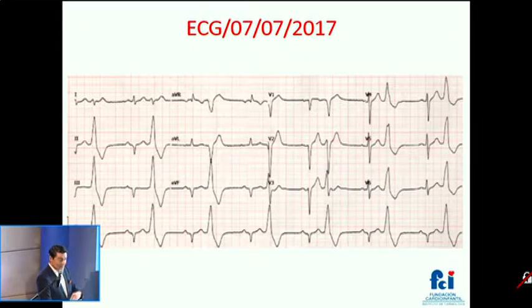When the origins of these arrhythmias start to drop in the tracts, that's when aVR can become negative, aVL can become isodiphasic and positive. So this pattern and the large voltage indicates that this is a very high structure in the heart, and according to the transition analysis, we have to differentiate whether it's in the right coronary cusp or the septal aspect of the outflow tract of the right ventricle.